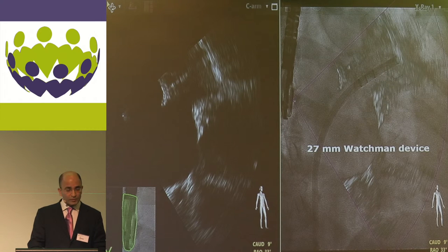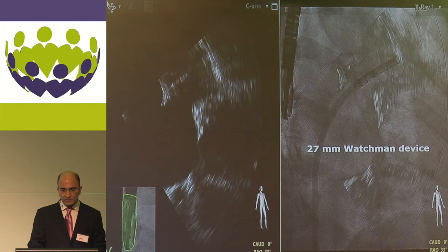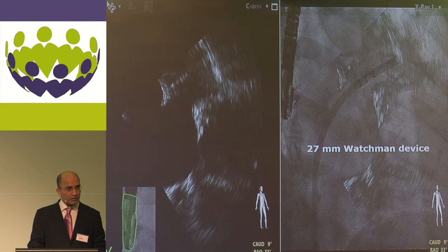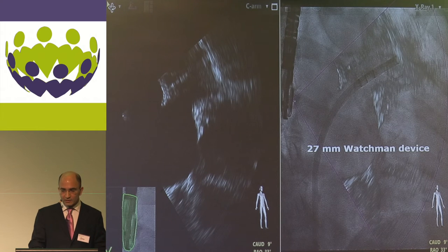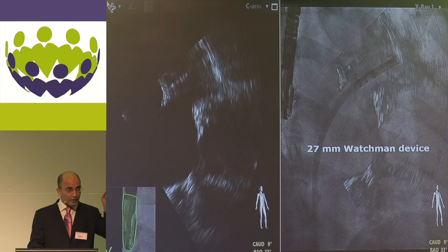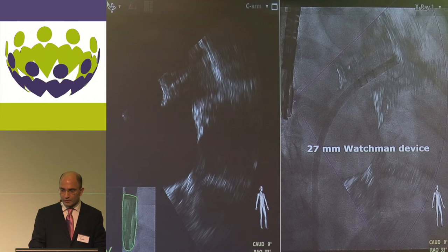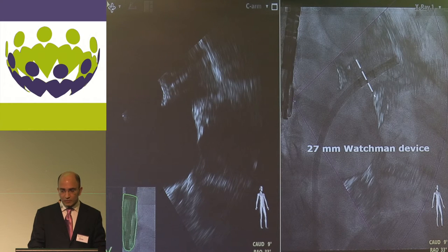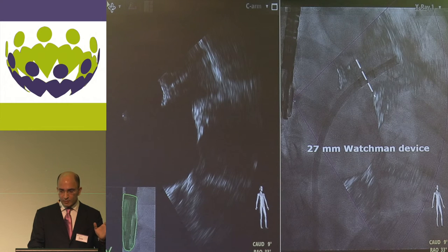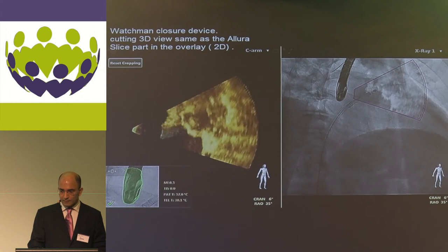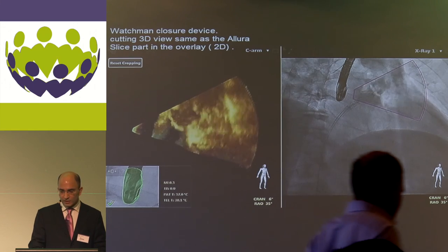For the Watchman device, this technology is particularly interesting. Once the catheter is inserted within the appendage and the device is loaded, you can no longer inject contrast, so you only have an approximate memory of where the ostium is. With this technology, you can very accurately place the marker of a 27mm Watchman device within the plane of the ostium. The final result can also be checked with this technology.